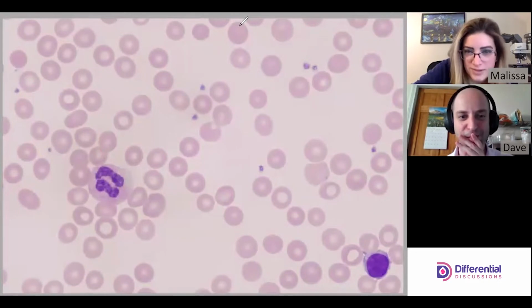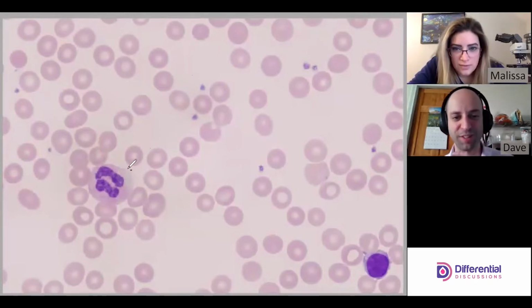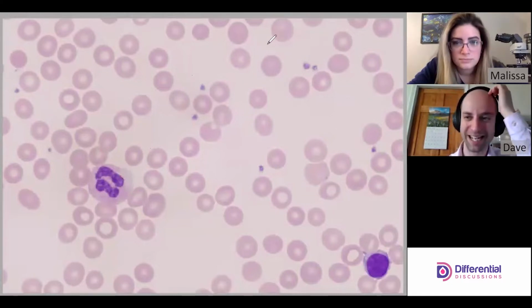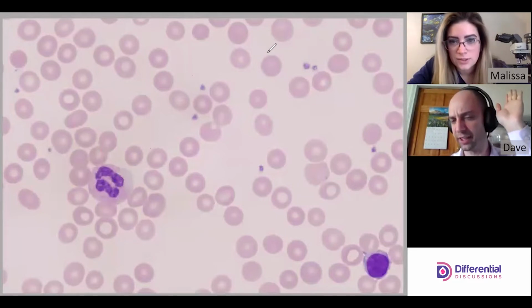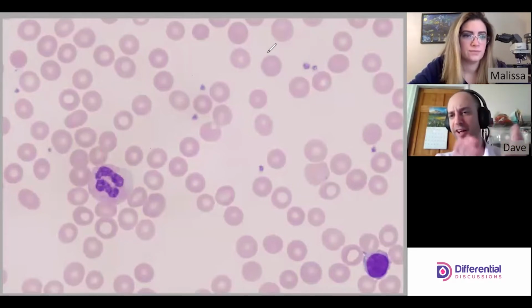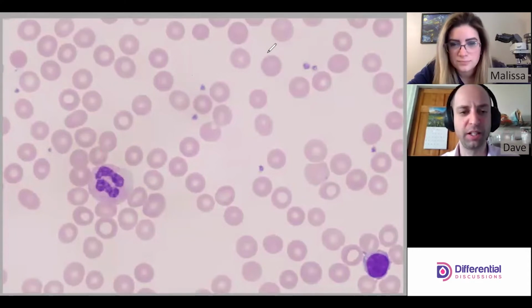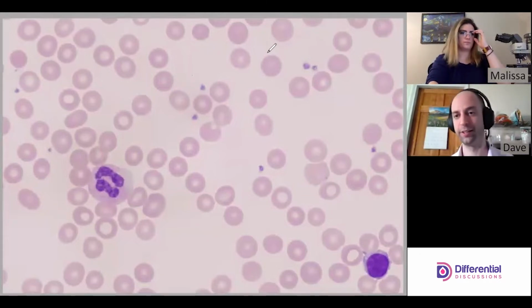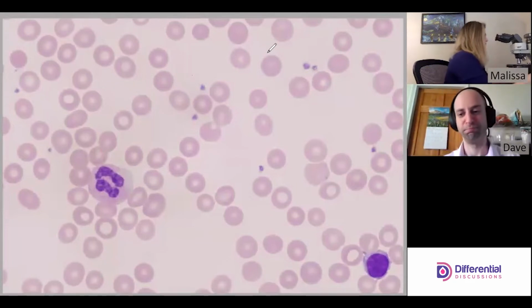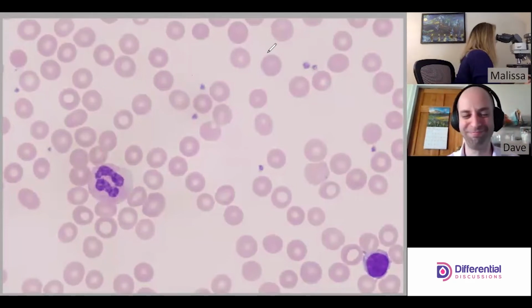And the cytoplasm's a bit naked there for whatever reason. I think it's probably more orientation and just being kind of squished. But it's a nice visualization of cytoplasm without anything in it stained in red stain.